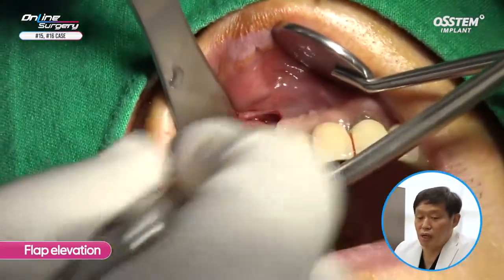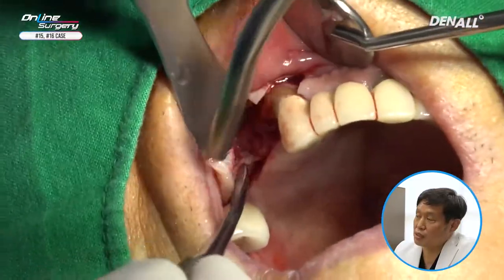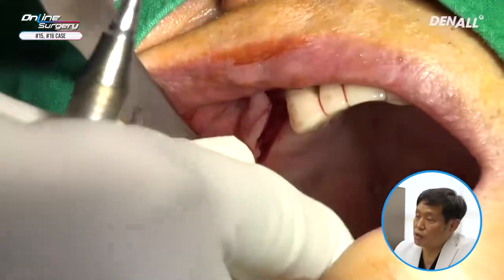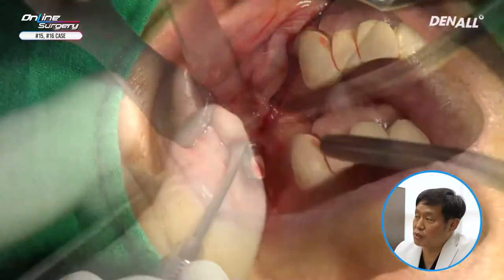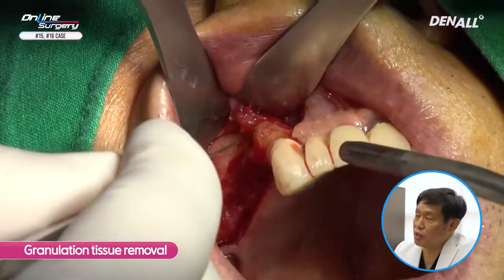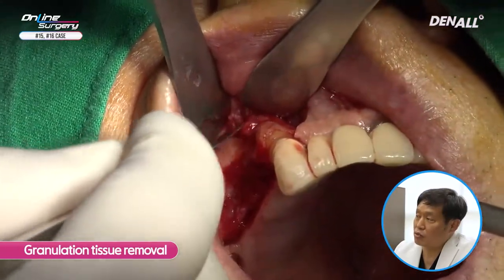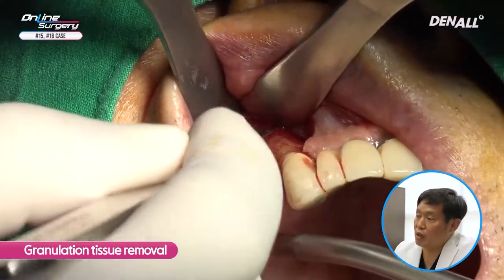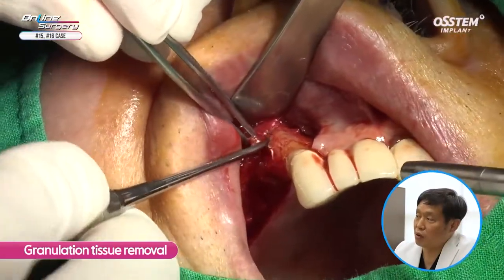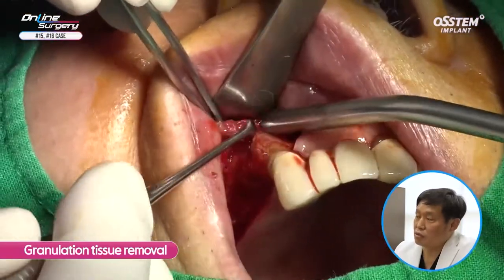Flap elevation is being done. On the distal side — the extraction site — healing is not fully done, so it's quite difficult. You can see that the crown of the implant on the distal side has become dislodged. It's removed. Flap elevation is done. On the apex side of the canine, it's exposed. The granulation tissue is stuck to the mucoperiosteal flap, so I'm removing it using a curette. Granulation tissue is fully removed.